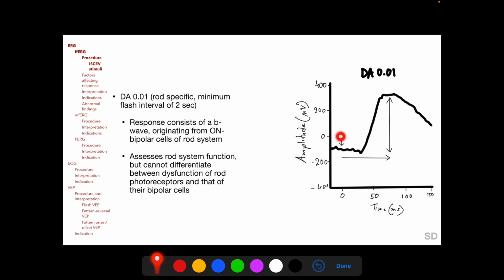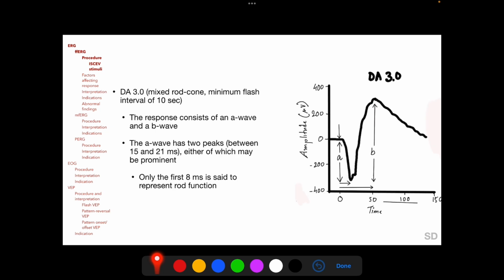This arrow represents the time when the stimulus is presented, which is recorded as 0 time along the x-axis, and this portion of the graph represents that recording of the response starts before the stimulus is presented. Time to peak of each response is measured from the time of stimulation, and the definition of amplitude of each response varies.